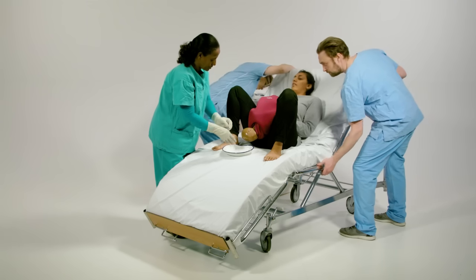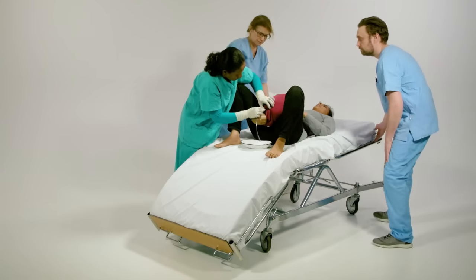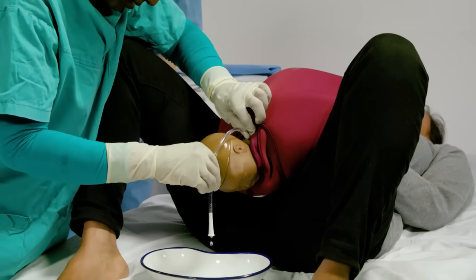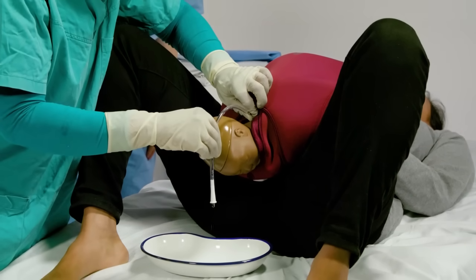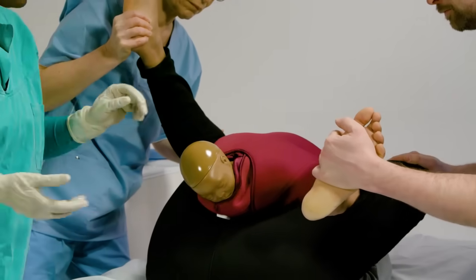Position the mother appropriately on the bed. Catheterise the mother and empty the bladder.